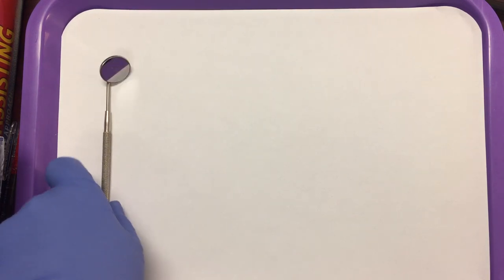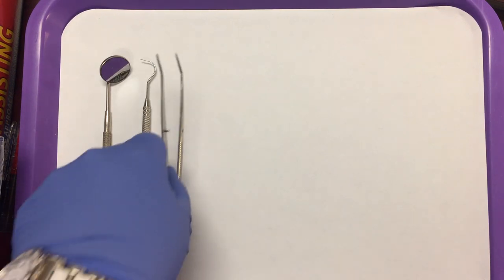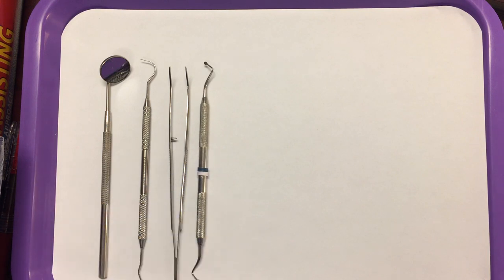As a dental assistant, you will need to know how to set up a crown and bridge preparation tray. We always start out with the basic setup, which is your mirror, explorer, and cotton pliers. And then just as you'd put on any other restorative tray, you would add your spoon excavator. So those are the first four instruments that you'd have on your preparation tray.